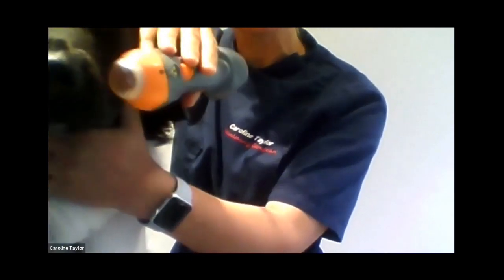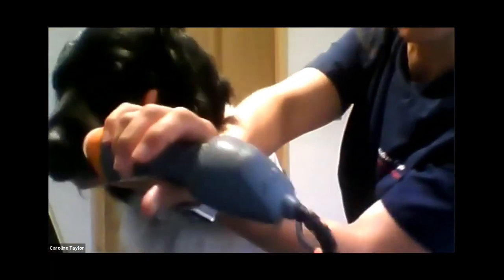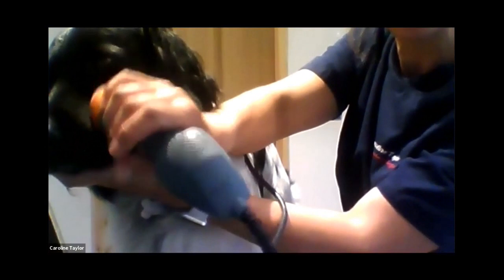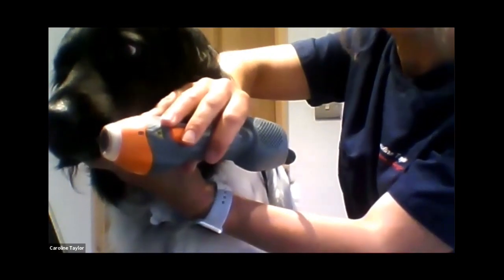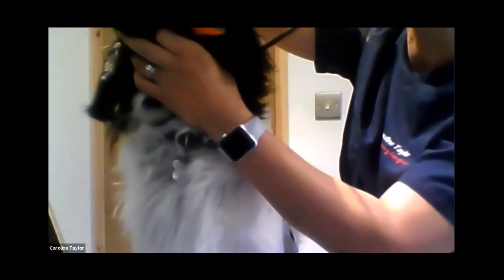But when you're actually using the laser, try and angle it from this direction forward, rather than coming from this angle, because then if they move, you'll be up into the eye very easily. So you want to come from caudal to cranial. And if you're treating a cat right at the back of the mouth, make sure you're not going down onto the thyroid or anything like that. So just be aware of where the scatter from the laser could be. That would be my advice on that.